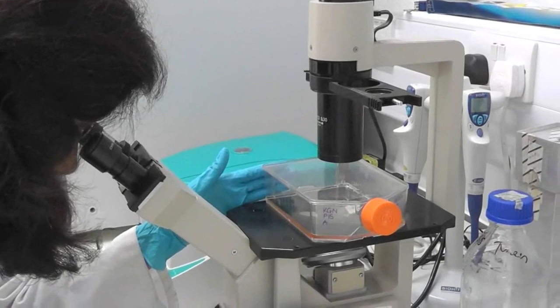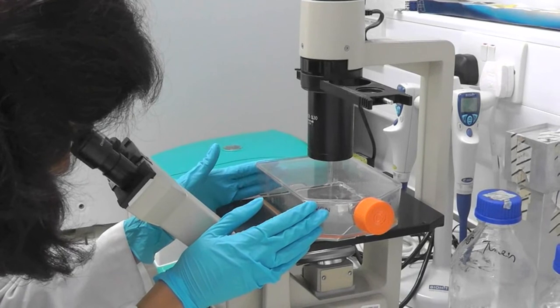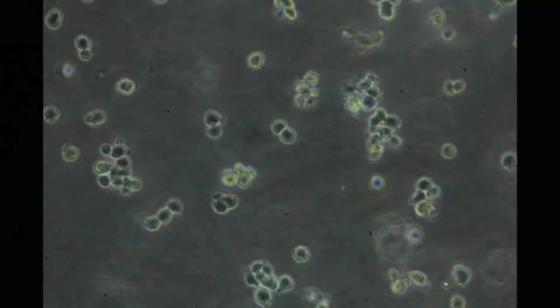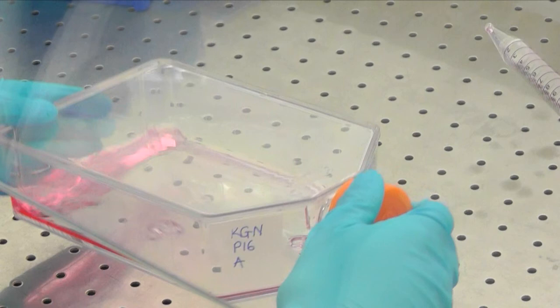After incubation, the researcher will check the cells under the microscope to check whether the cells have dissociated from one another. Dissociated cells will look circular in appearance, and in this example, approximately 90% of the cells were observed to be detached. If cells still remain attached to the flask at this point, the flask can be given a gentle tap on the side, and this often dislodges the cells.